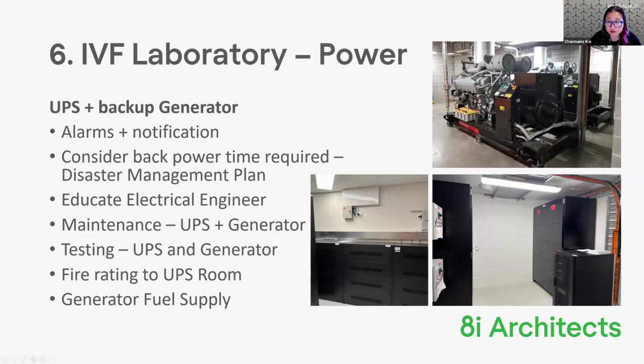The two images down the bottom here are both UPS rooms. The UPSs are massive. In Australia, it triggers fire rating requirements because UPSs can catch on fire, which means we've got to put it into a fire rated room. The other thing to know with UPSs is that they need to be air conditioned because they do heat up. So there are extra costs in running an air conditioning system to keep the UPSs cool.